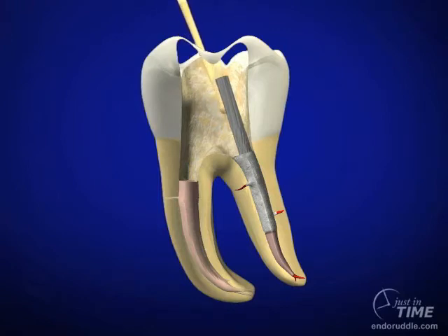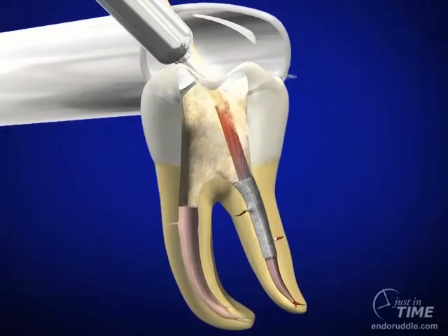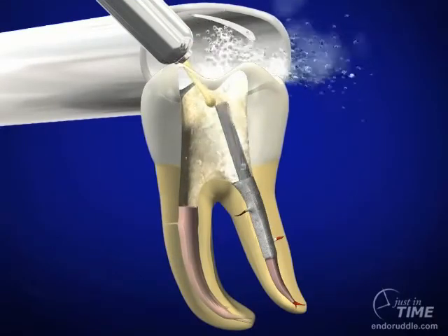Be aware that when we're transferring energy into an all-metal post, heat is our enemy. About every 15 to 20 seconds, it's important to have the chair-side assistant flush out the field, wick off growing heat, and keep the post cool so the transfer through dentin will not occur out to the attachment apparatus.